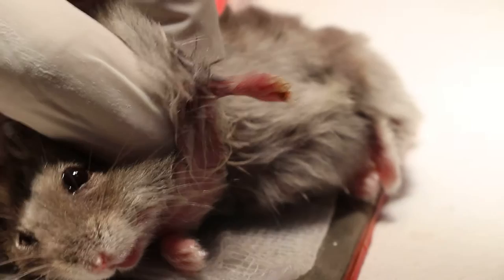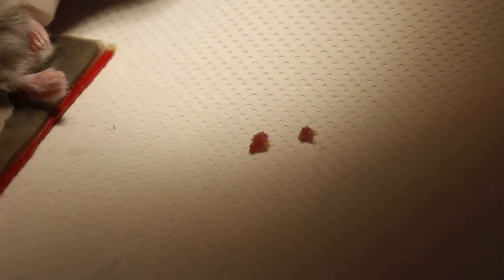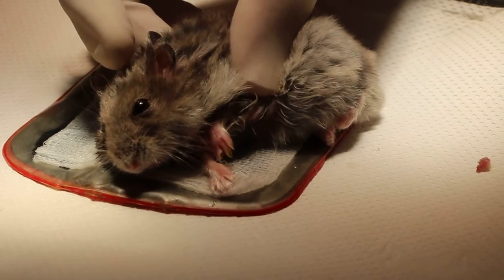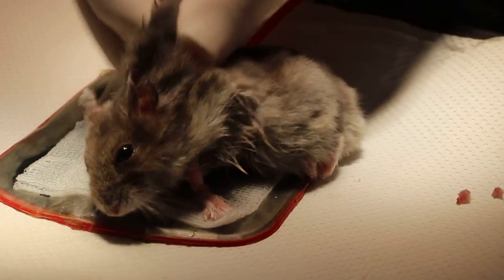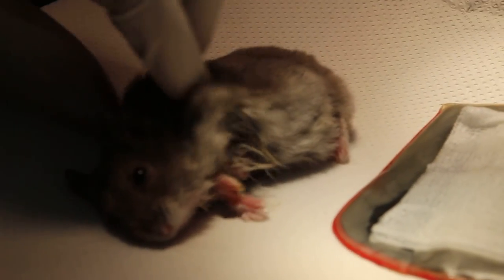Okay, finished. That's it. Electrosurgery, no bleeding. Any bleeding? No, it's very good. Still was under anesthetic. These two wads will give it to the owner. Both are no bleeding. Female one, earformed ones. Okay, go back to the warm place.